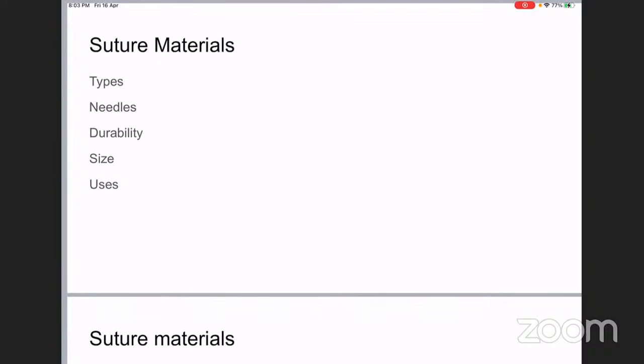One other thing you need to know is a property of suture materials known as memory. Suture materials come in packaging, folded on themselves and placed compactly inside a package. Once you remove the suture material from the package, you might have noticed that in some suture materials, the way in which it was packed is retained. Even if you try to pull it straight and release it, it will coil back again.